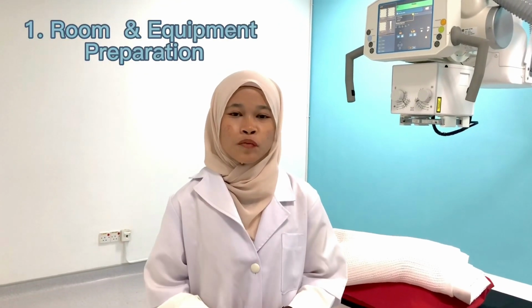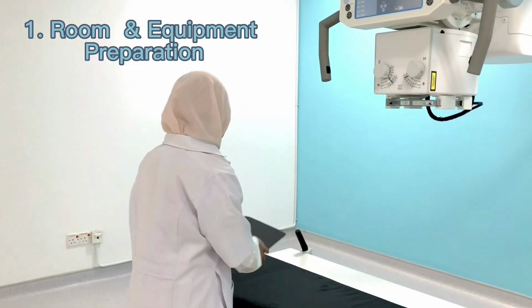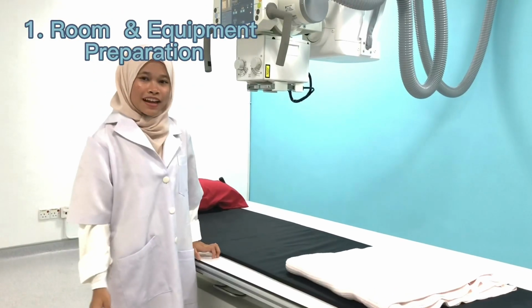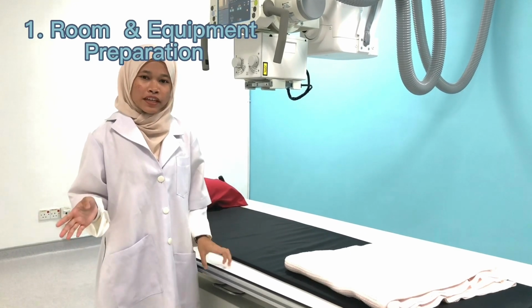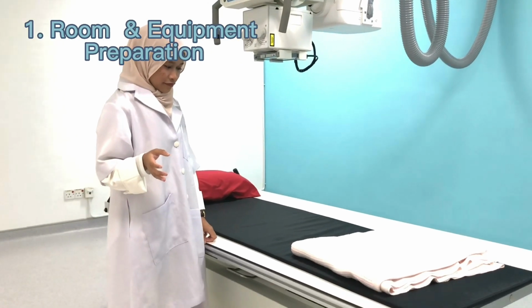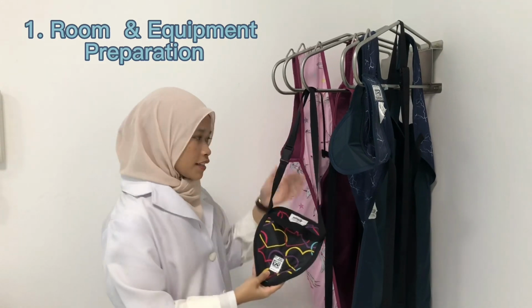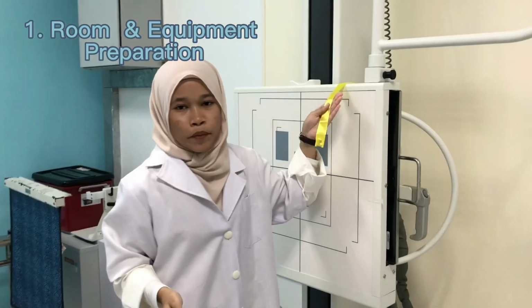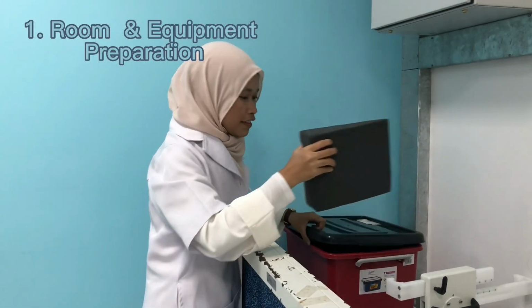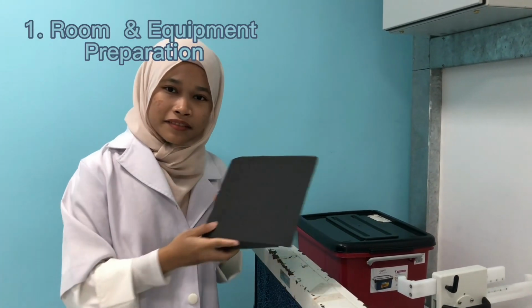First, I will make sure the room is ready and comfortable for the patient to come in for the examination. I will lower down the table for the patient to get on easily. Then I will prepare the gonad shield for protection. The lead marker is to determine the site of the image. I also will get a sponge for support for the patient's head.